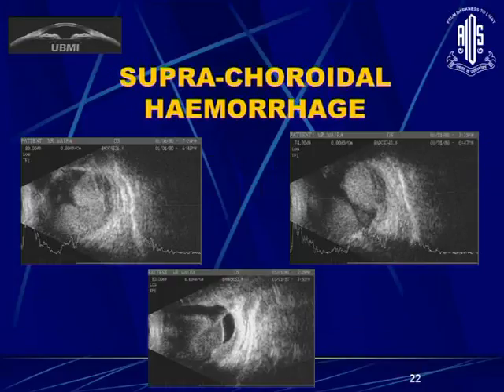I had a patient who was an 80-year-old gentleman, army man, who had sudden loss of vision on one side, and there was nothing seen. It was just a red glow inside the eye. If you see this ultrasound, it definitely looks like a choroidal mass. You know, your bumpy lesion here in an 80-year-old, I thought probably it is a metastatic lesion, doesn't look like a melanoma. This gentleman just vanished. He said, I don't want to do anything in the eye, and probably came after 6 months or 8 months, I don't remember.